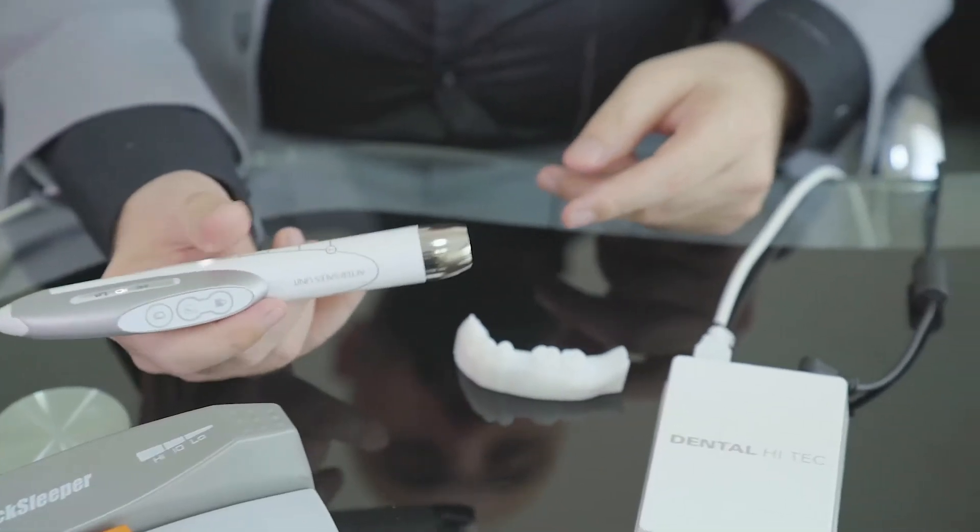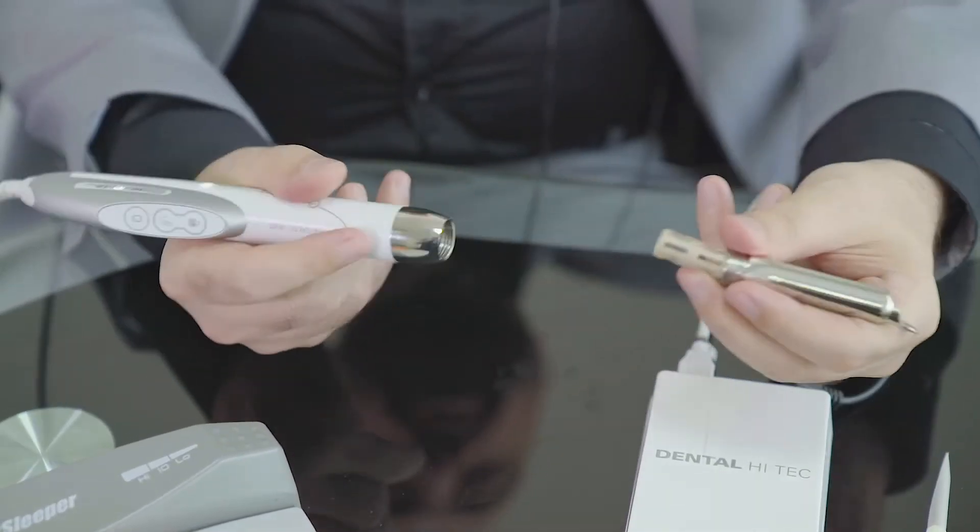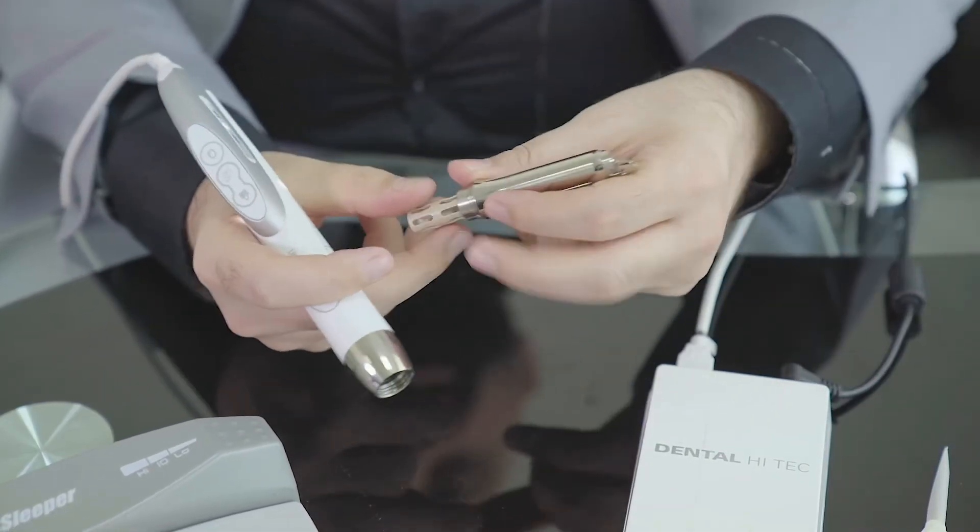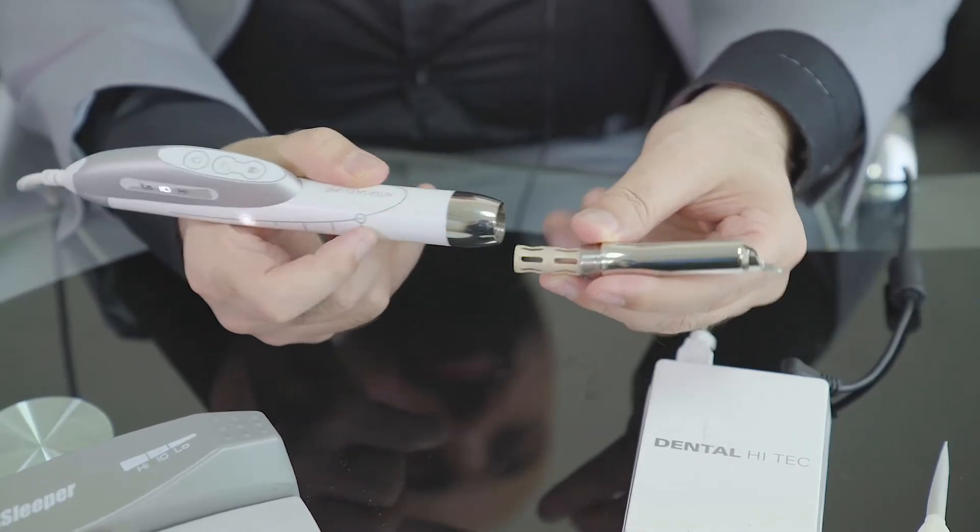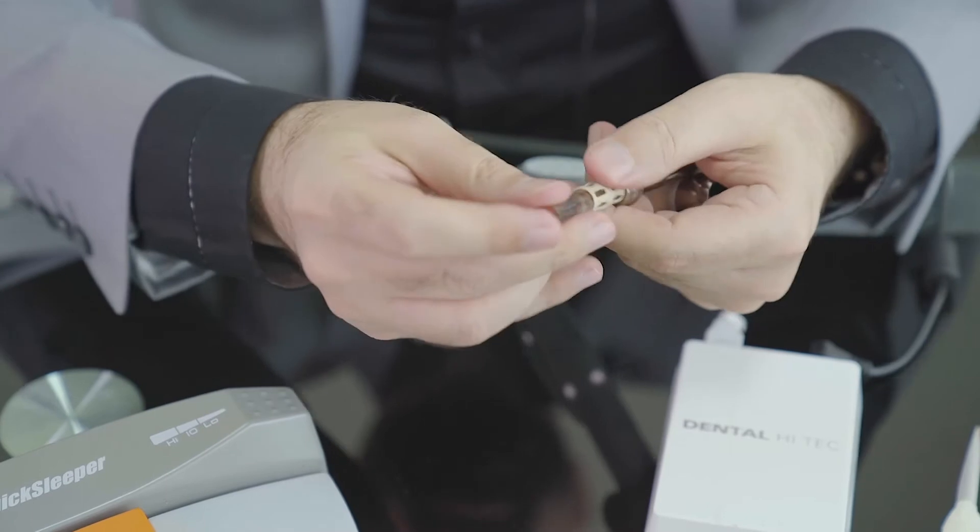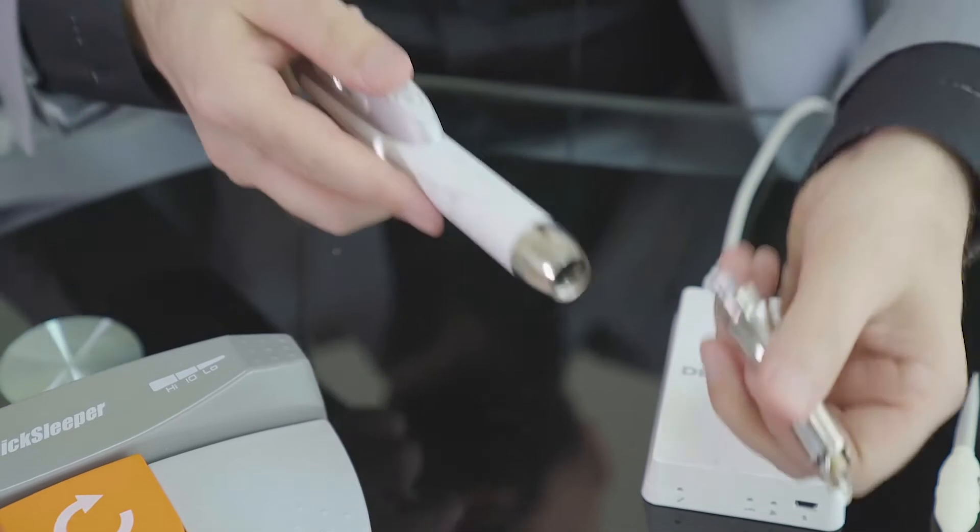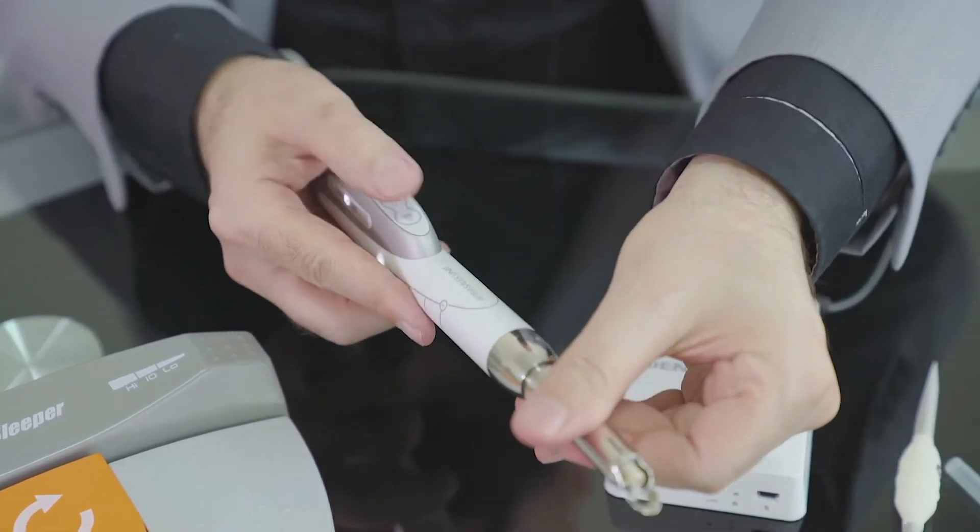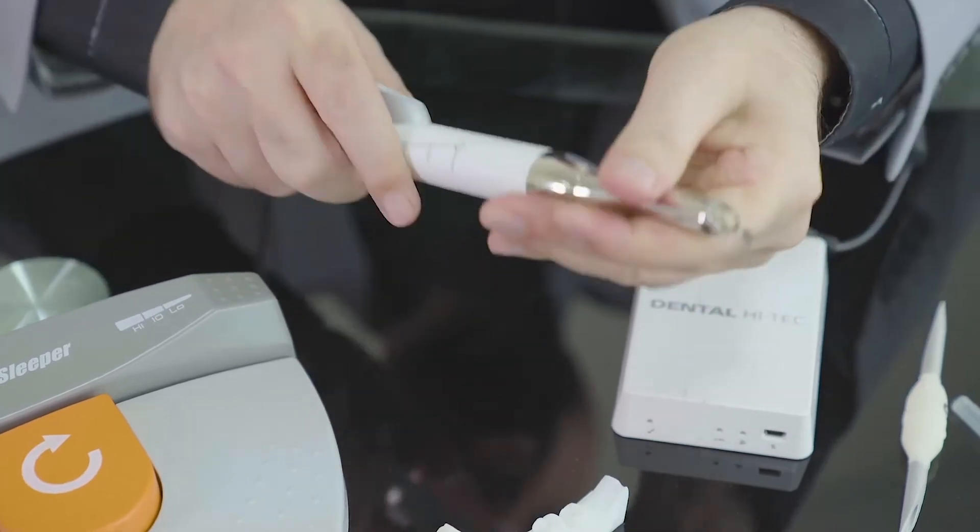For the installation, before starting to use Quick Sleeper to do intraosseous, we will use this container, the metal container. It's a very unique and special container to include the cartridge and to do rotation upon using Quick Sleeper for intraosseous. I place my cartridge inside the container and I screw it over the head of the handpiece, like this.